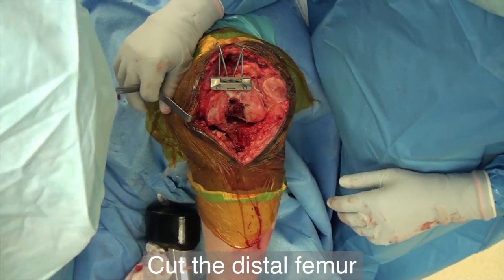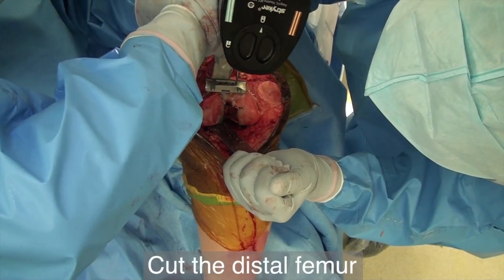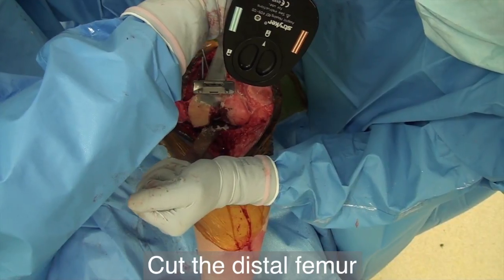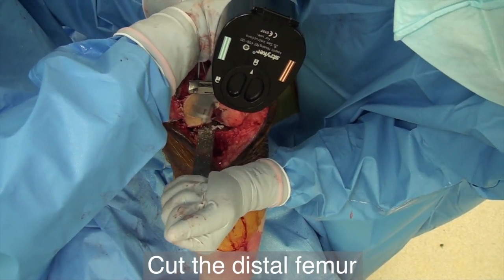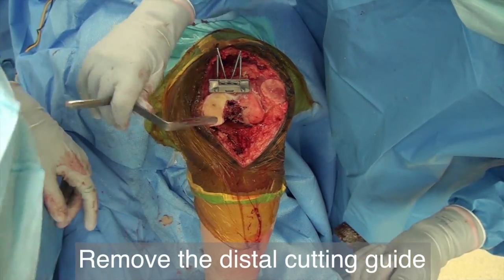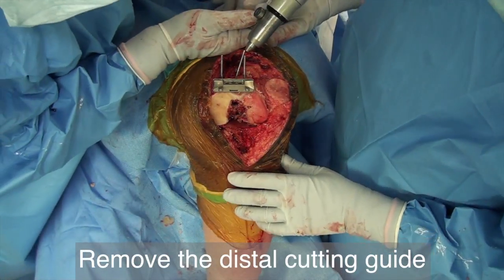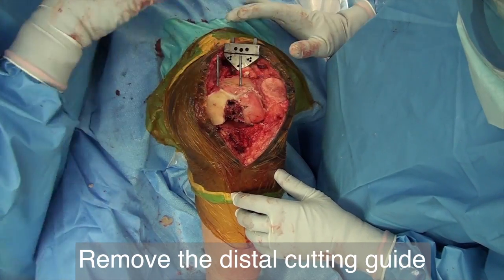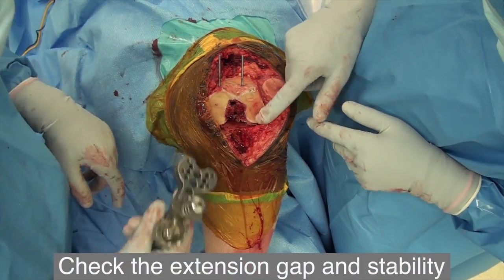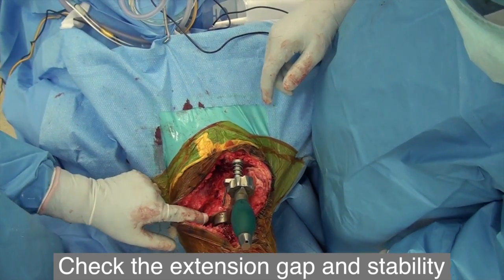Position the Z retractor to protect the patellar tendon. Use the 1-inch straight osteotome to protect the tibial surface and perform the distal cut of the lateral condyle. Reposition the Z retractor to the medial side to protect the MCL; again use the straight osteotome to protect the tibia and perform the cut on the medial condyle. As you cut, make sure the cuts are straight, as the blade has a tendency to bend away from the bone. Remove the cross pins and distal cutting guide.